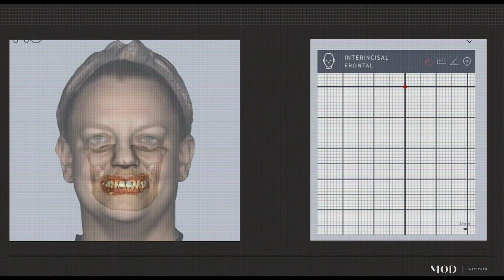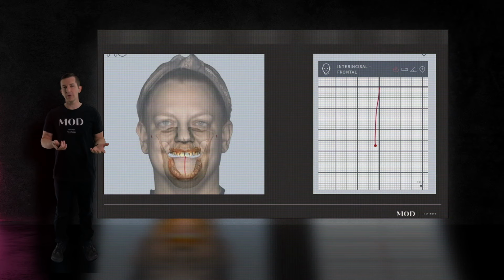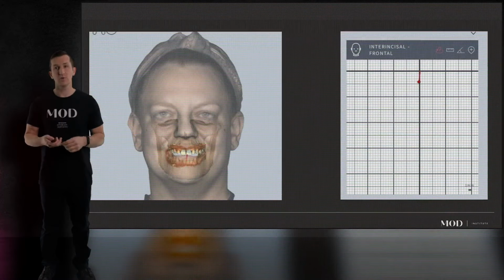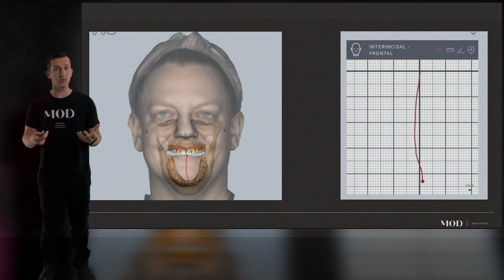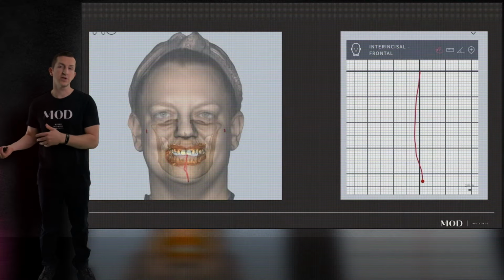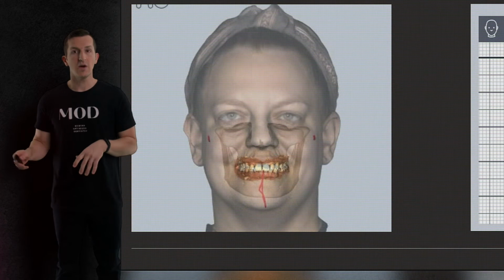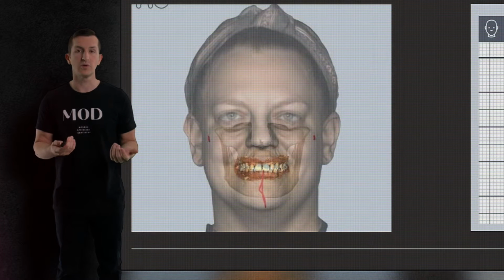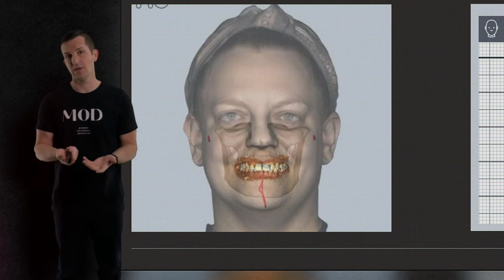And so for this patient, when you look at her opening and closing, you can see a deviation that would potentially be very difficult to pick up if you're just using a typical analog workflow as part of your diagnostic. What that can do is provide us insights that help us have discussions with our patients on the front end about dysfunctions that we're seeing within their temporomandibular joint, which can help us in how we plan our treatment.